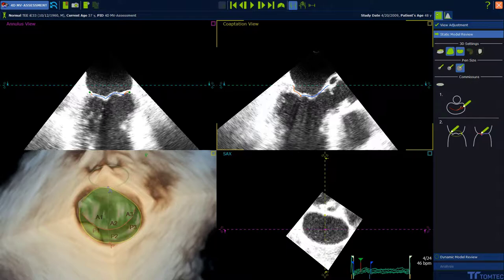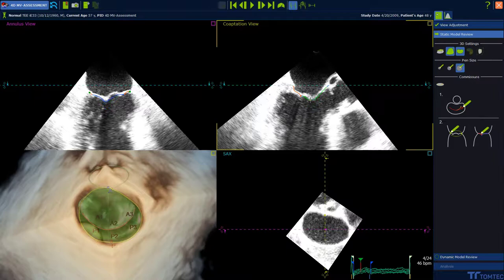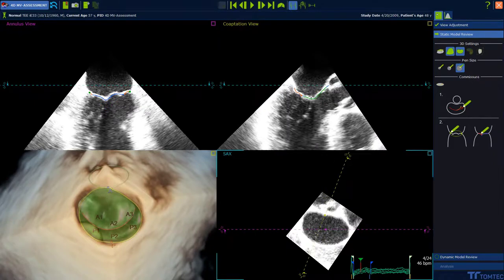At the upper view, the proposed contour can be adjusted by drag and drop if necessary. You can also rotate by grabbing both lines and make further adjustments.